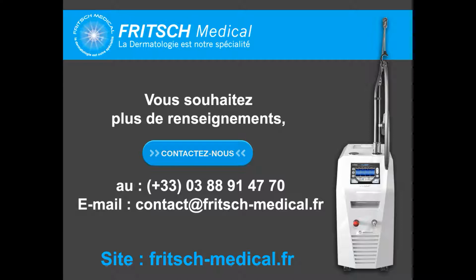If you hear a small pop, that means you have too much blood in the vessel, and you have to reduce the energy. Very important. It's clinical, it's visual. If the vessel doesn't disappear and you just have an edema, you come again a few seconds after, and sometimes it takes more time to disappear because the blood flow is stopped. So it's necessary to make another shot.